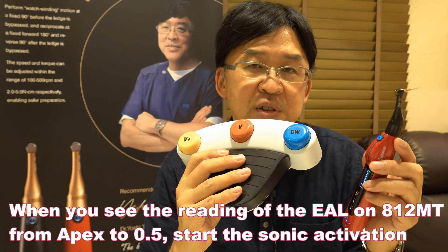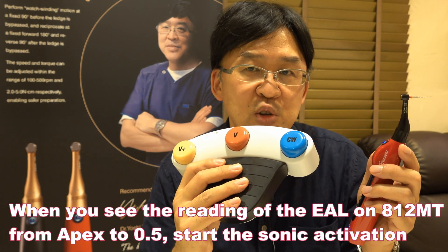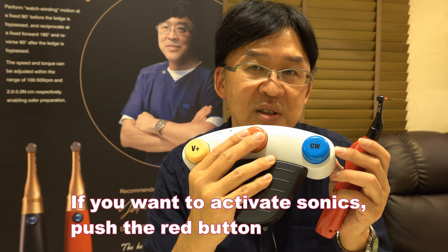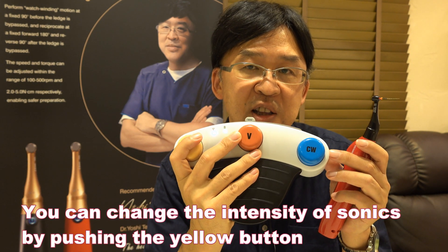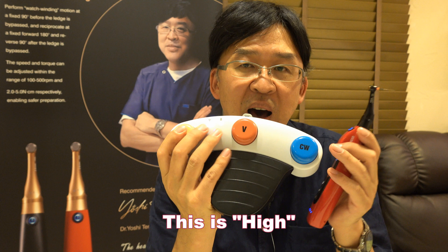If you see the reading of the apex locator on 812MT from apex to 0.5, then you can start sonic. If you want to activate sonic, push the red button. You can change the intensity of sonic by pushing the yellow one — low, medium, or high.